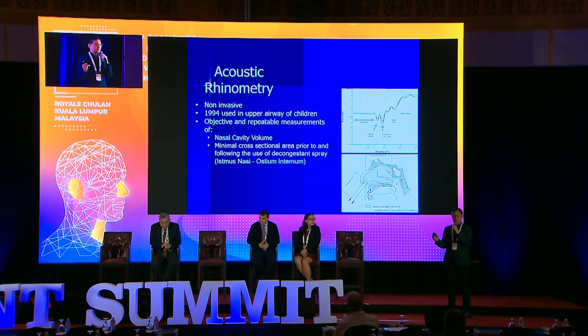But for acoustic rhinometry, I have to mention, and it was pointed out by Mari to me a while ago, that in a study that was in a journal that was published by Jacqueline Correa, if the MCSA, the minimal cross-sectional area, is less than 0.6 centimeter, that may predict the compliance of a person using a CPAP.